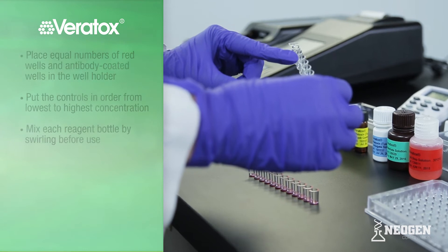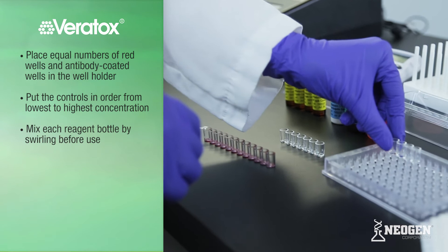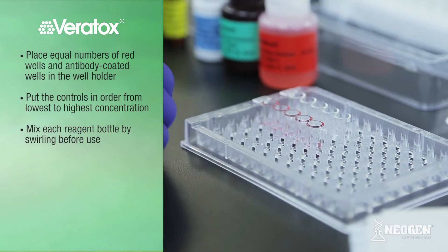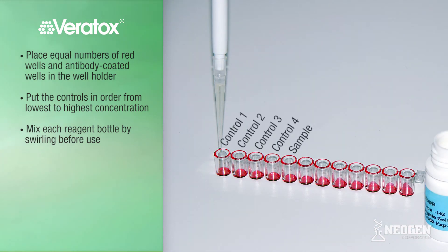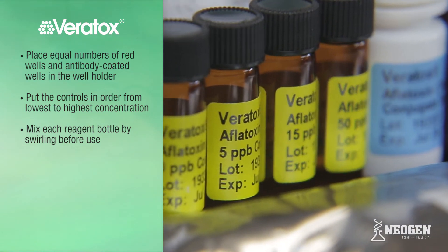To set up your test, place equal numbers of red mixing wells and clear antibody-coated wells in the well holder. You will need one well for each control and an additional well for each sample. For our demonstration, we will test one sample on the Veritox for Aflatoxin test kit; therefore, we will need a total of five wells — one for each of the four controls and one for our sample. Multiple samples can be tested at one time, but Neogen recommends running no more than 20 samples at one time for a total of 24 wells.